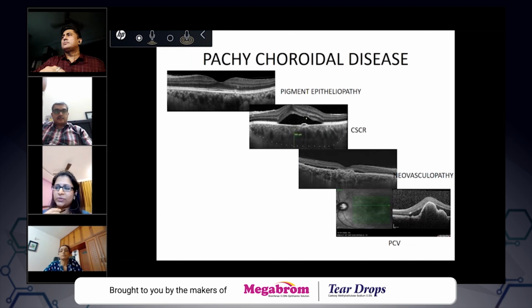Sir, I wanted to know whether you are giving test doses before angiogram at your institute. Yeah, test dose is given, sir. And is the angiogram done in the presence of an anesthetist, or is physician fitness taken before doing the angiogram? Every patient will have a physician fitness, that is for sure. But the anesthetist will be available in the hospital, on call. He or she will come in 2 minutes time, or in 10 minutes time, but will be available, and may not come to the angiogram room as such.